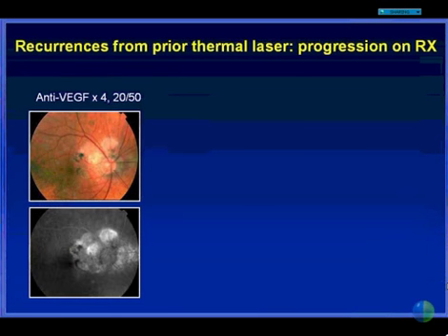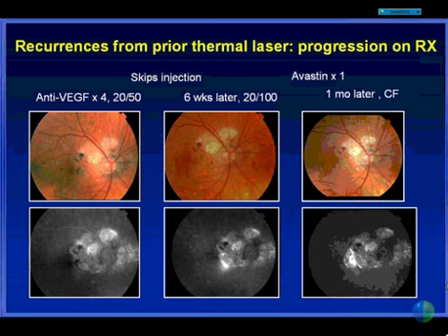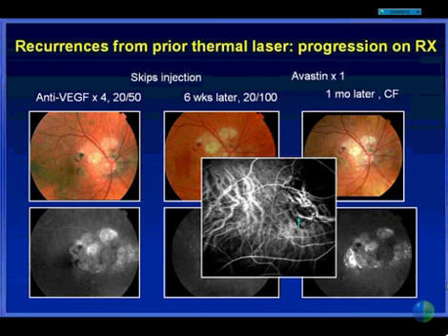Here's an example of a patient with peripapillary CNV who did very well with anti-VEGF therapy, showing that the lesion became inactive, skipped a single injection, and there was a recurrence. Patient was reinduced. The recurrence enlarged in spite of reinduction, and ICG demonstrated that the patient had a large caliber feeder vessel with many branching arteries and minimal capillary portion. Again, these branching vessels and feeder vessels do not appear to be anti-VEGF responsive.